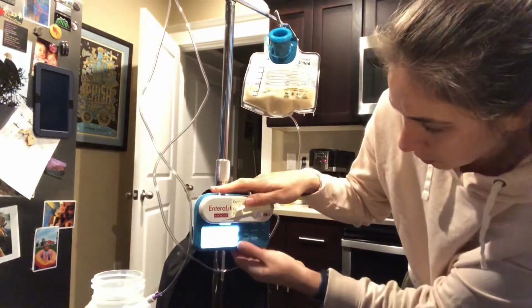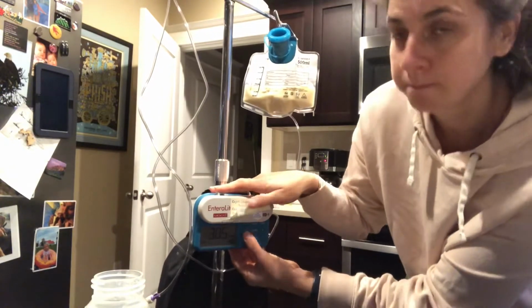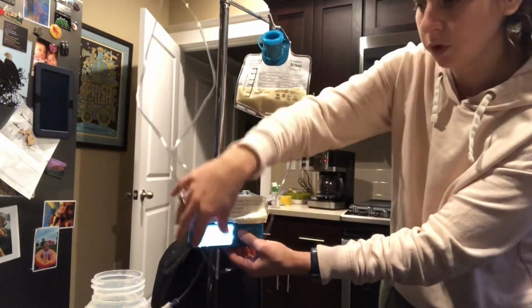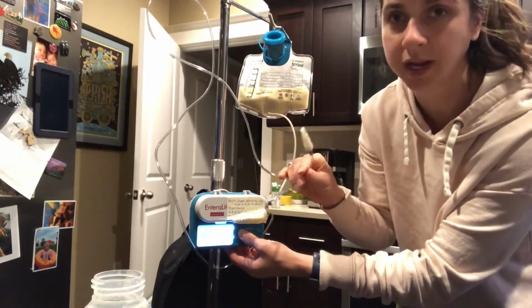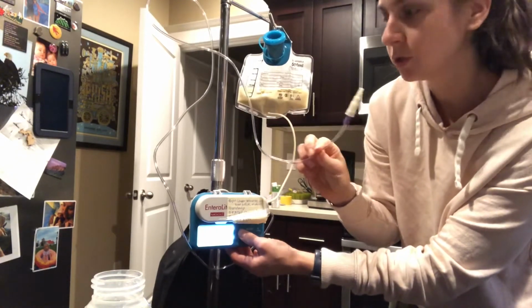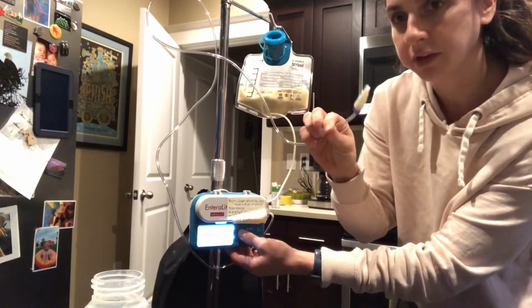And then what you're going to do is the middle button here, you're going to push, it says prime. That's going to start running the milk through the tube. The biggest thing, of course there'll be tiny little air bubbles sometimes, but you don't want to put any air into her stomach. So you need all the air to be out of this tube. So you're just priming all of the formula through to the end of the tube.